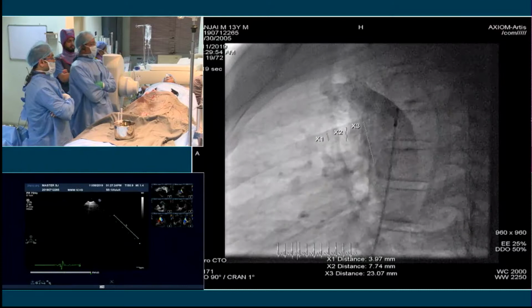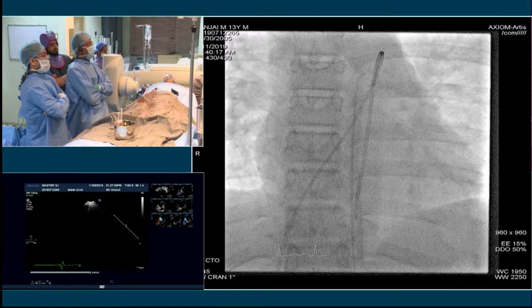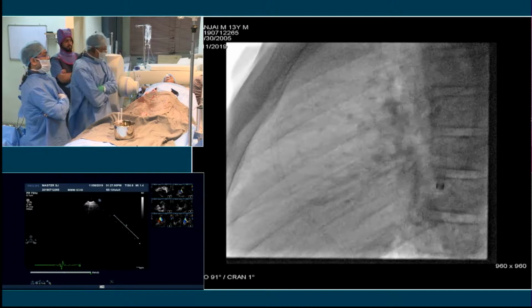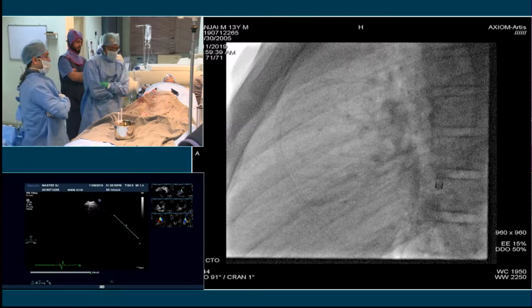Yeah, next. So we already crossed the PDA. Yeah. Play. Next. Next. Yeah, next. Is it as one? Play it. Okay, so this is the position now. Right now we just have the catheter across. This is a 7 French Mullins sheath. So we are planning to go with the 8/6. This is the Occlutec we are attempting.